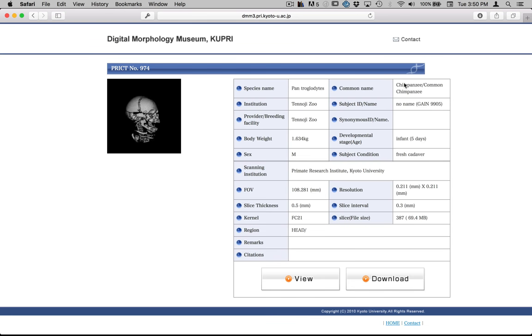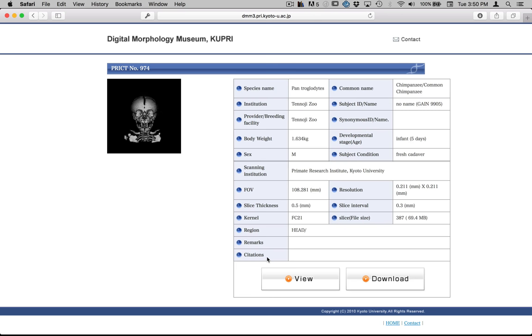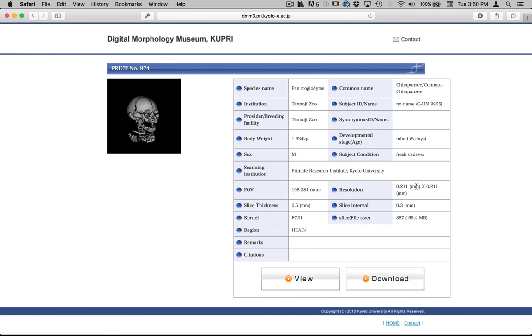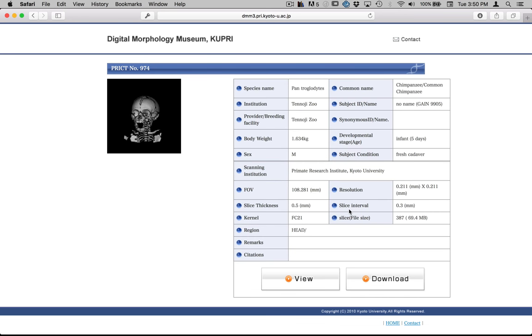So all the data about the CT scan is included here and about the specimen, where they're from. This is a five-day-old infant, for example. But I've already downloaded this for you.